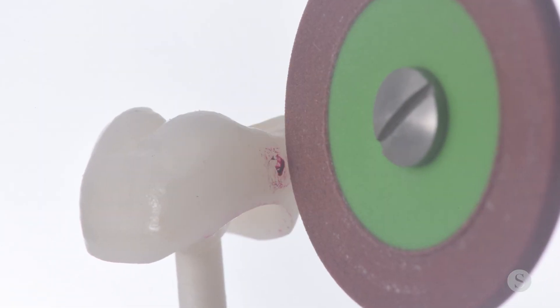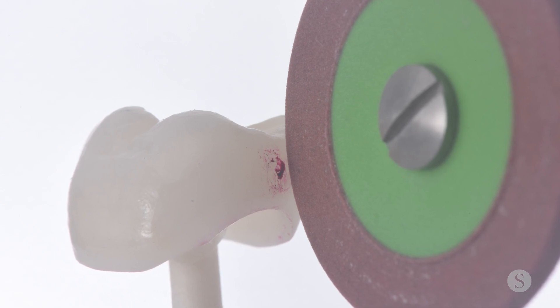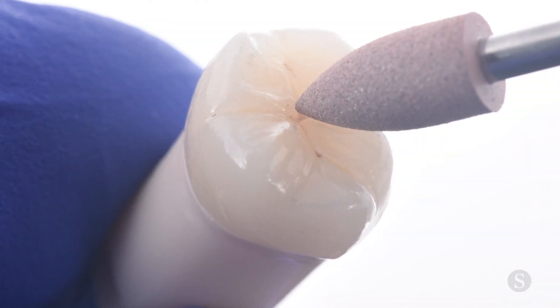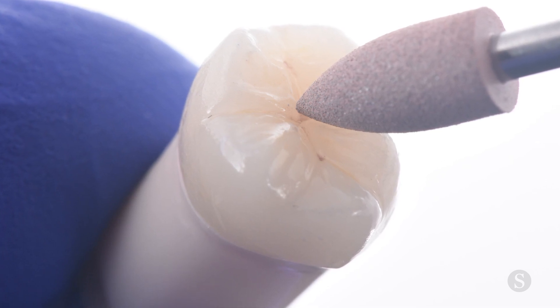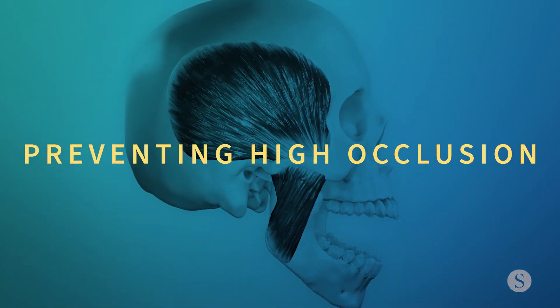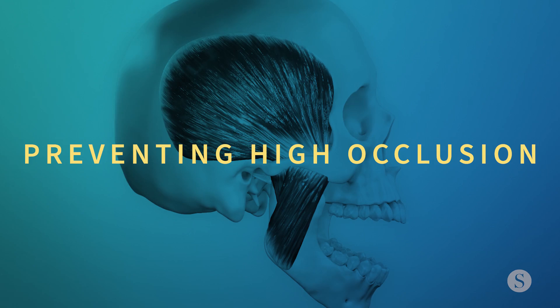When choosing the polishing wheel diameter, larger sizes are more effective and efficient. However, a rubber abrasive point may be necessary for reaching the depth of the anatomy, despite its limited effectiveness due to its size. So it is essential to ensure a stable intercuspation between both arches.